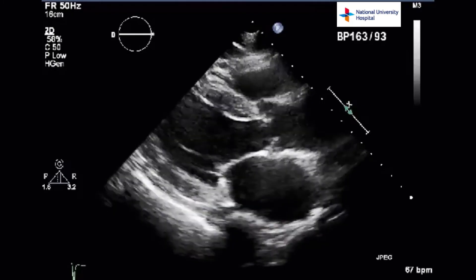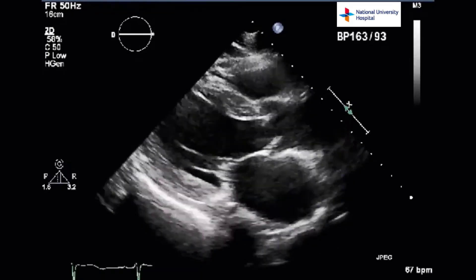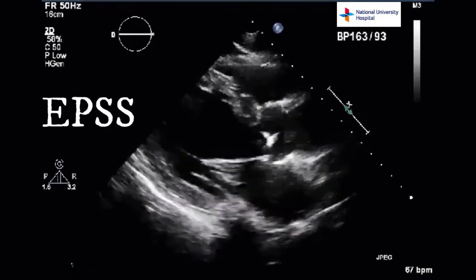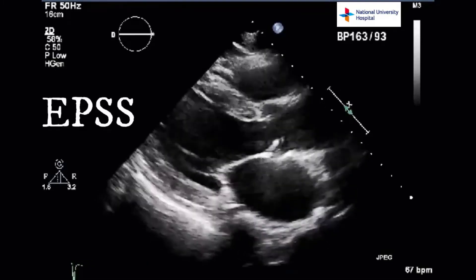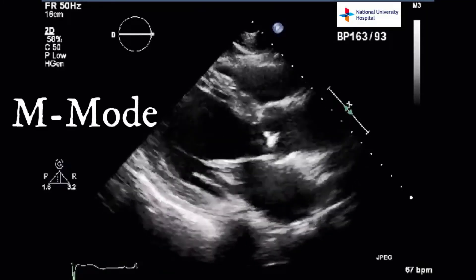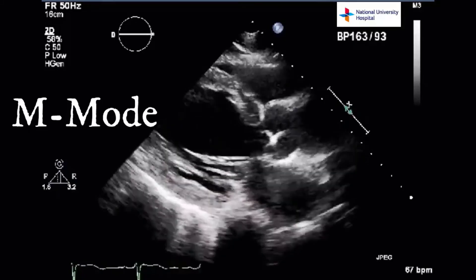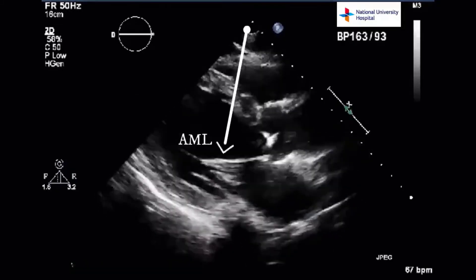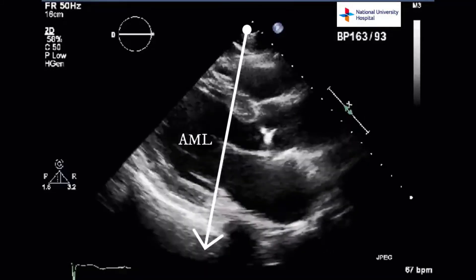Finally, we will look at EPSS, or E-point septal separation. This is another method of quantifying LV systolic function. This is a quick guide on how to obtain the EPSS measurement from the parasternal long axis view. EPSS refers to E-point septal separation. It is an easily obtained measurement that has been validated as a reliable surrogate for ejection fraction. M-mode is used to obtain the EPSS measurement. The M-mode tracer is placed over the distal tip of the anterior leaflet of the mitral valve as shown here.